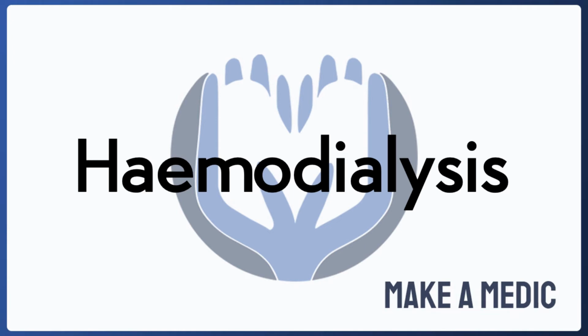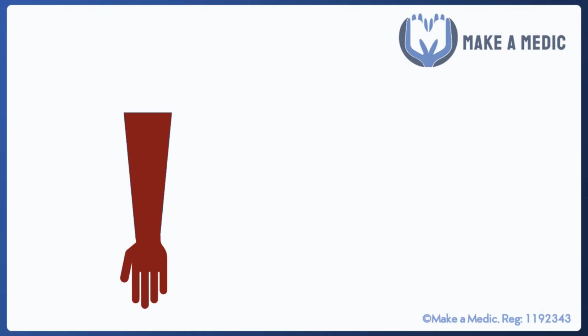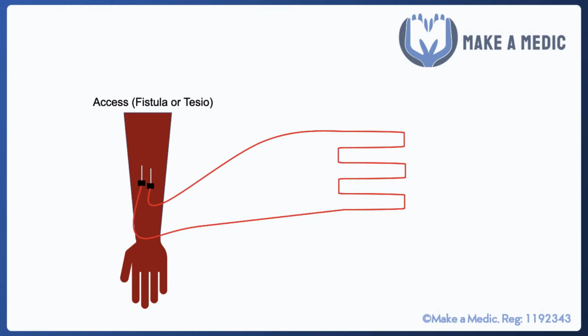Today we're going to be talking about hemodialysis. So hemodialysis is a renal replacement therapy that is used by lots of patients across the world. Practically speaking, the way that it works is that you have access to the patient's circulation either through a fistula, which is an arteriovenous anastomosis usually found within the arm, or via a tessio line, which is a form of tunneled central line. Through this access, you can extract the blood from one port and infuse it back into the body through another.